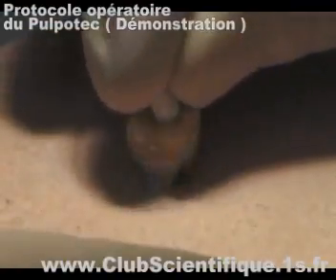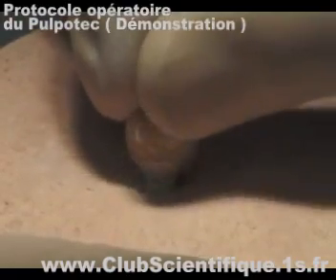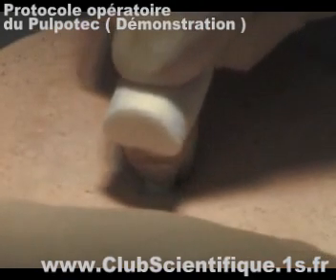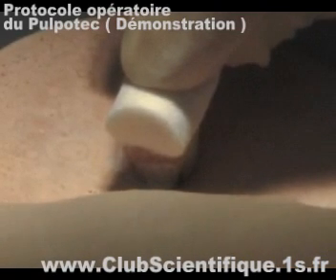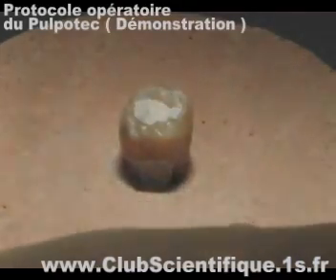Fill the tooth with a temporary cement, taking care to place a cotton roll between the two dental arches. The pulp paste will increase the pressure so that the Pulpatec paste clings to the walls of the pulp cavity as well as to the root canal openings.